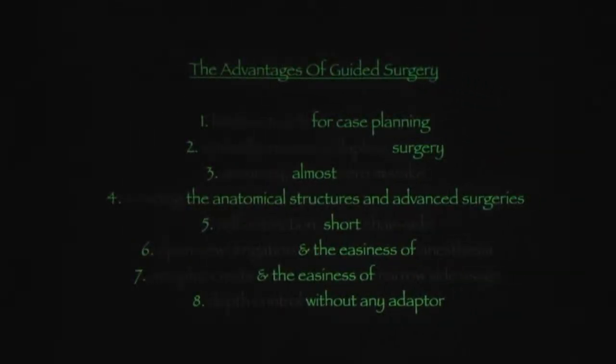So, the advantages of guided surgery. The first one is the limitless touch for case planning, minimally invasive and flapless surgery. The third one is accuracy, which is the most important part for guided surgery. It's almost zero mistakes.